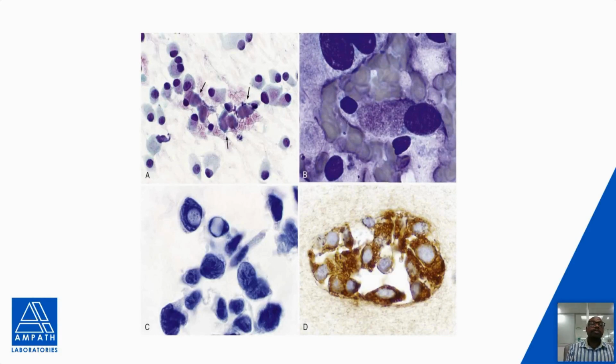And on micrograph A, this is how they say it usually looks, to have these eccentric nuclei, which are hyperchromatic. You may have even nuclear pseudo-inclusions, but you'll find that you don't have the other features of papillary thyroid carcinoma. So this was the calcitonin stain, which helped them to clinch the diagnosis.